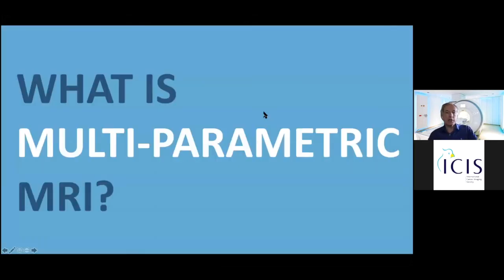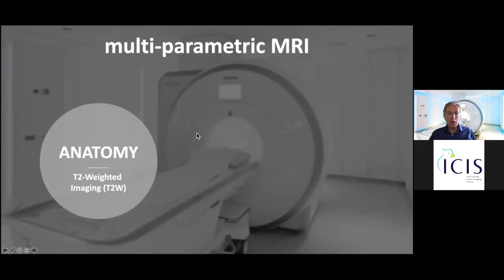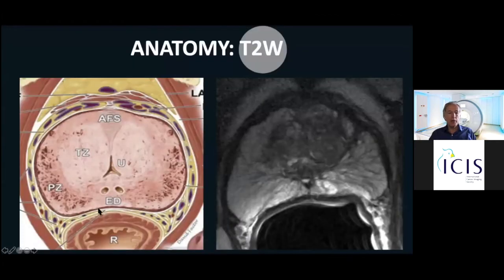Let's get started. What is multi-parametric MRI? Multi-parametric MRI consists of 3 techniques that help each other, as you can see here. The first technique is T2 weighted imaging that shows anatomy. Just like a drawing in black and white, you can see the structures of the prostate. This is a normal prostate with the peripheral zone being bright and some mixed signal intensity, the transition zone.